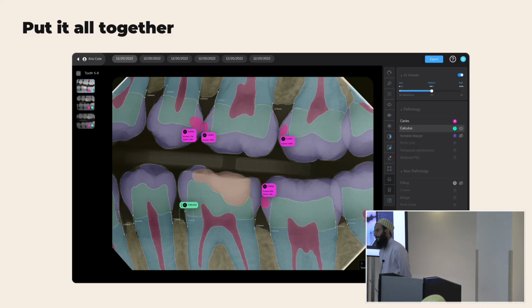so much like you draw the ROC curve. Yes. Yeah, that's exactly what happens. But to simplify, it means at this percent confidence. Like that's what the neural network does, right? When it predicts, when it tells you its confidence, it's basically calculating the area under the curve, kind of, at different cutoffs, and that's how you get your rates.